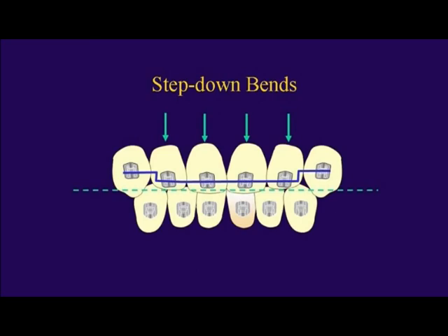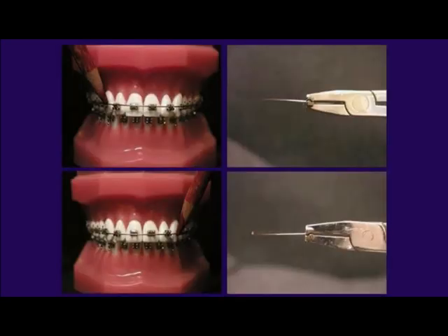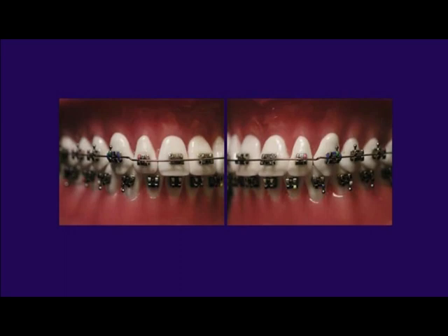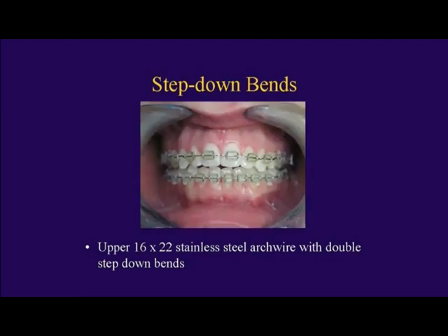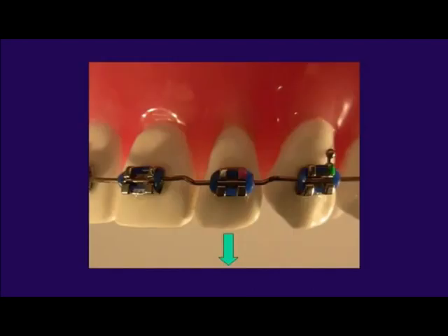This is also the kind of bend we do post extrusion open bite piggyback to maintain what we've done, because remember your bracket slots aren't lined up. Mark the position, come in with your plier at 90 degrees, squeeze very firmly for a nice crisp bend, mark the other side, and make the bend. Now you have a nice step bend — in this case between the canine and lateral incisor — to keep those teeth down post piggyback. There's no limit to the amount of step bends you can do to finalize the incisal position of teeth and correct incisal-gingival discrepancies.